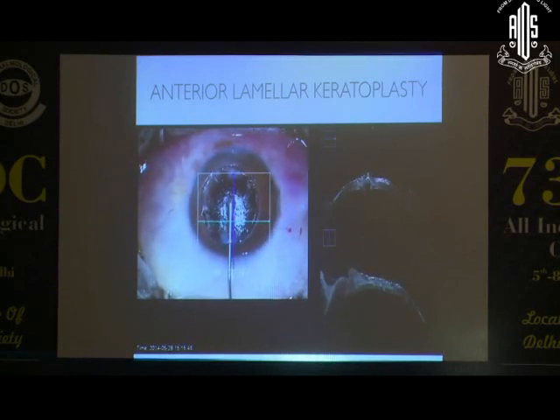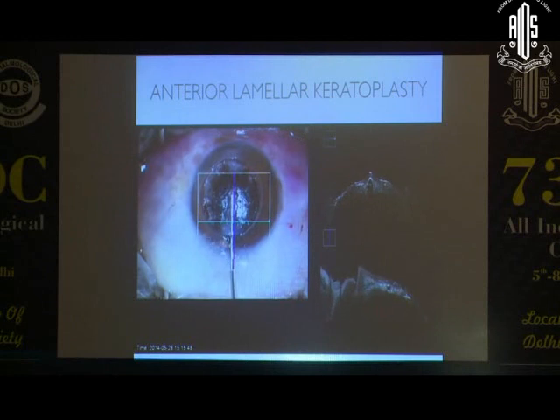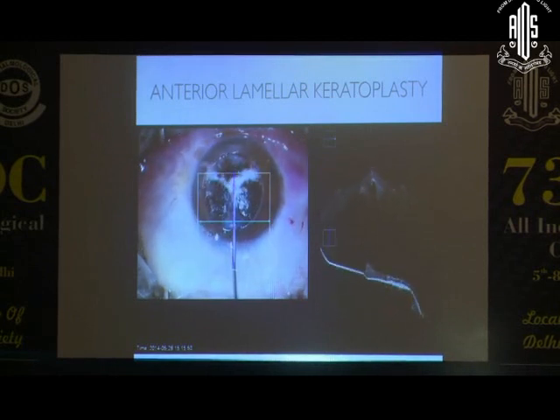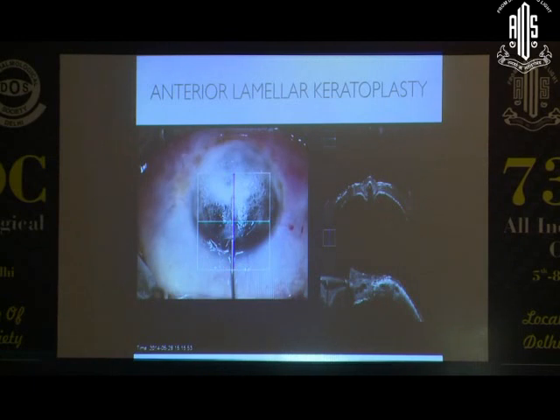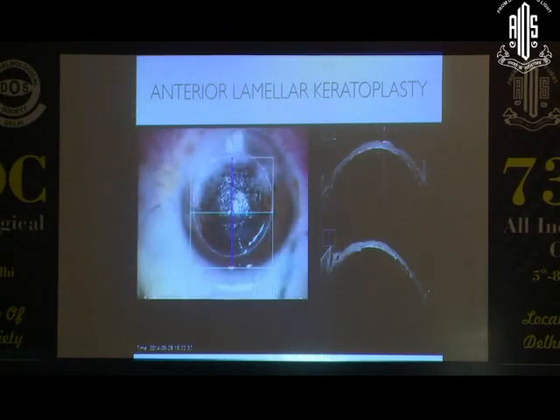And once you inject your air, you will see that you have a very nice bubble because you're very posterior in the stroma. So this is a bubble that I have got. And interestingly enough, I actually got a type 2 bubble. So you can see the bubble that is present in this video. And I got a type 2 bubble and not a type 1 bubble.